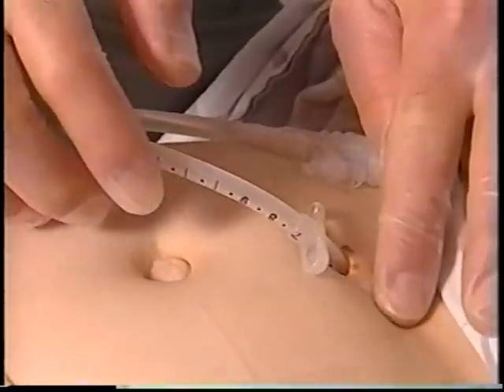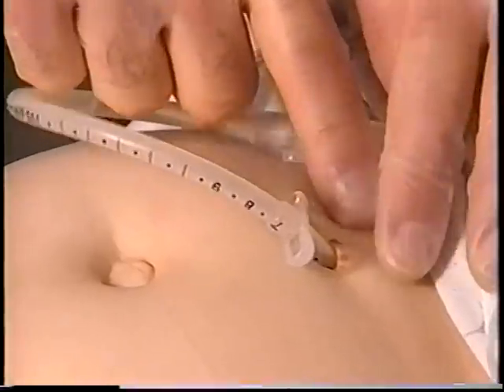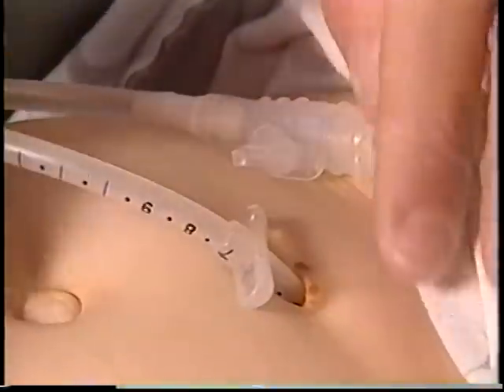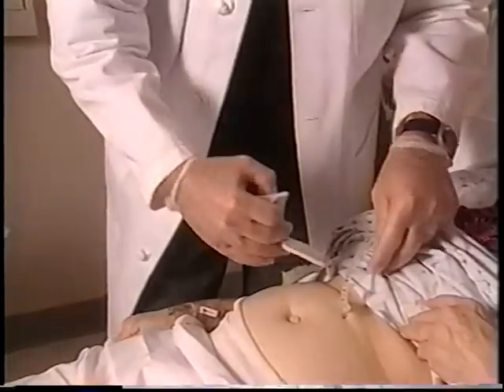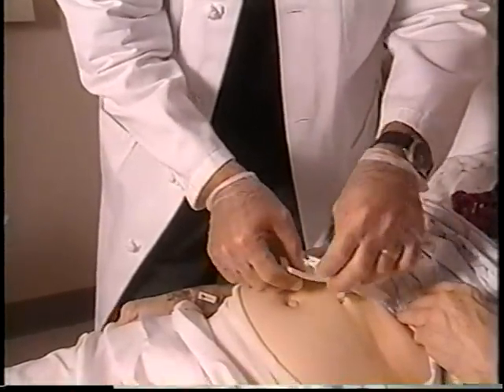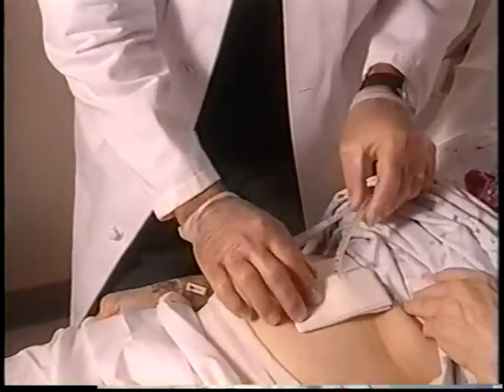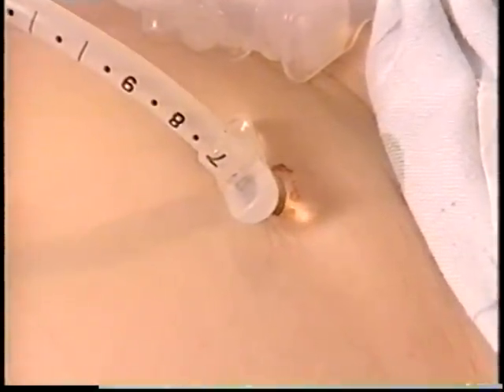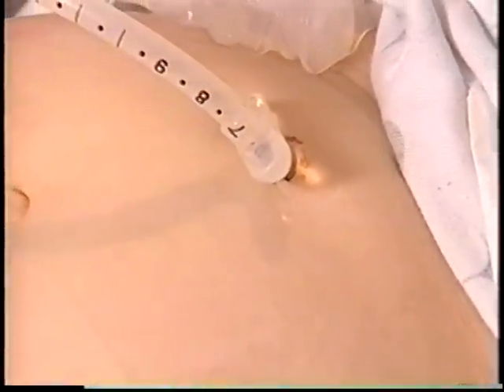As part of stoma care, the site should be assessed for redness, pain or soreness, swelling, or drainage. If any of these are noted, the physician should be notified. A dressing is then reapplied with the drain sponges positioned over the external bolster. After a few days of healing, the site can be cleaned with mild soap and water and left open to air.